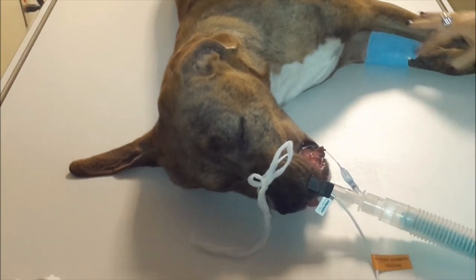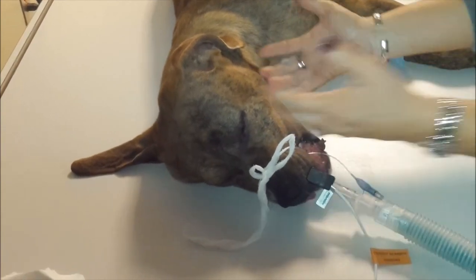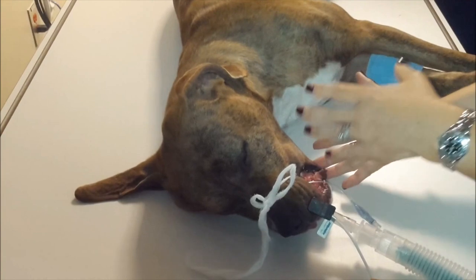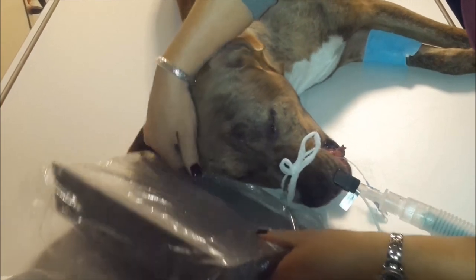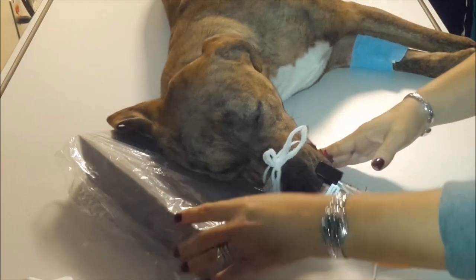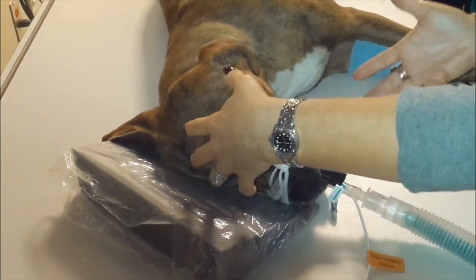For the lateral skull, typically when you place your animal down, it's already oblique lateral. If you want to oblique it more, you can just take a sponge or a wedge and lift that up so that it's tipped even more. Some heads tip more than others — if you have the real big block heads, they don't tip as much.